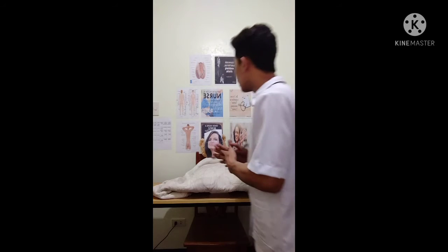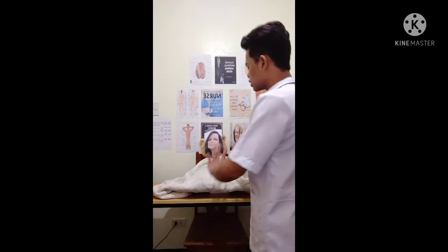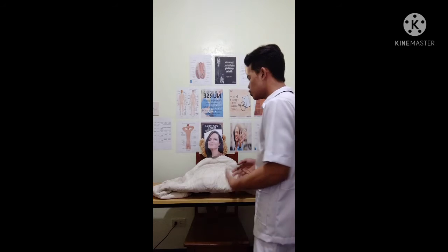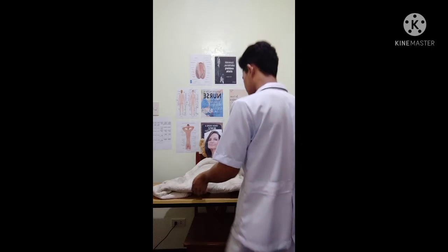Okay, so ma'am, I'm going to drape na po para ma-expose lang ang ating genital area po as I'm going to do the procedure. Okay po, ma'am? Thank you, ma'am.